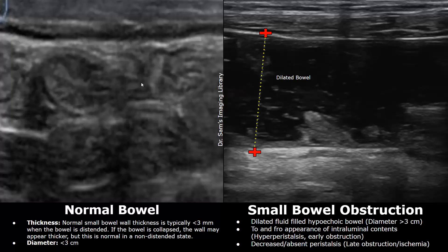When the bowel is not distended, the wall may appear thicker, but this is normal in a non-distended bowel. The normal diameter of the bowel is less than three centimeters. The image on the right is a case of small bowel obstruction — you can see a dilated hypoechoic fluid-filled bowel with a diameter of more than three centimeters.